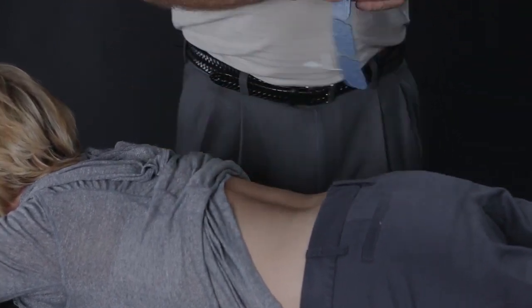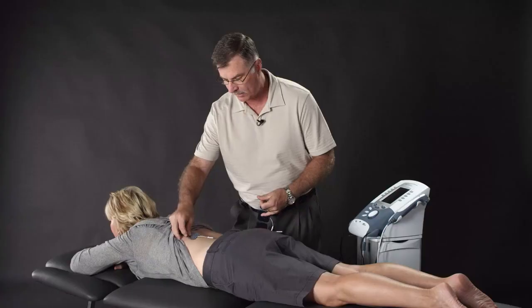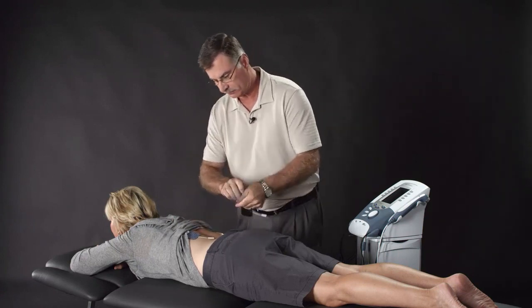We will then place the electrodes on the skin. Remember, with interferential, we want to do this in a crossing pattern. So since we're treating the whole low back, we're going to put 4 electrodes on the patient.